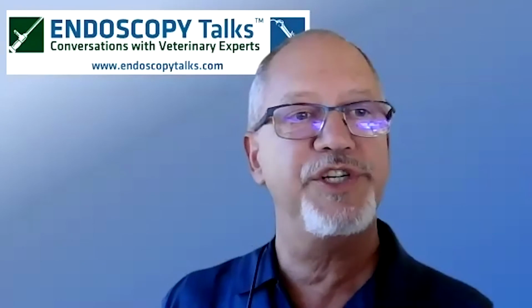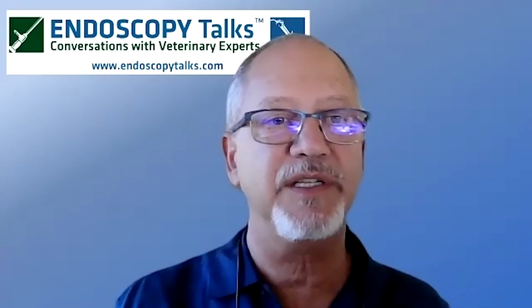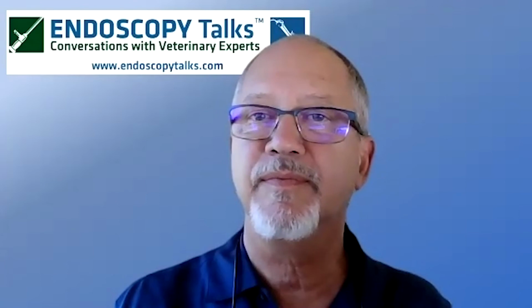Got it. Next question, and this could be for any of the three of you: do you have a recommendation for a 3 or 4 prong grasper that can take a large bite? The ones we have don't engage with the foreign body until they are almost closed. They retract so narrowly that the bite they can take makes them more or less ineffective. I guess personally, I would agree. They tend to be ineffective forceps to me, and I don't use them very often for that reason.